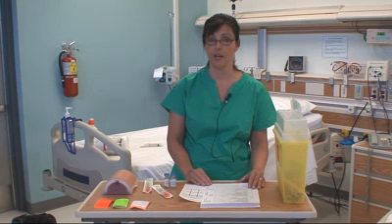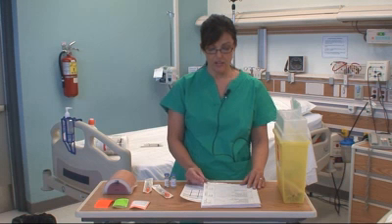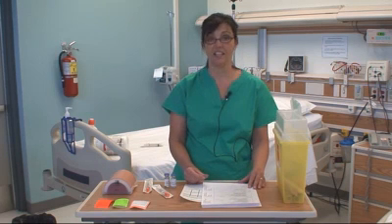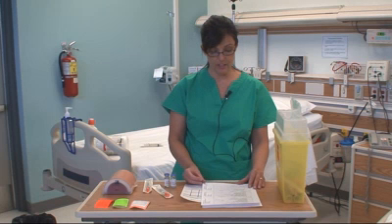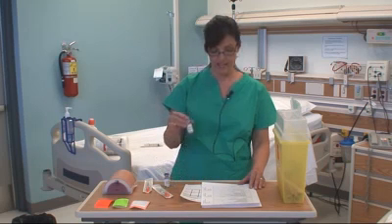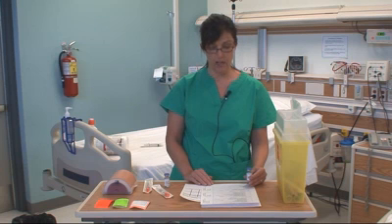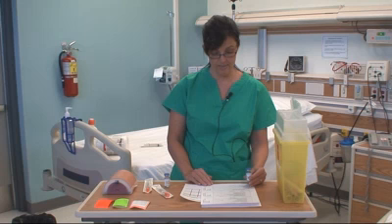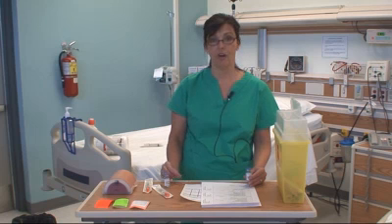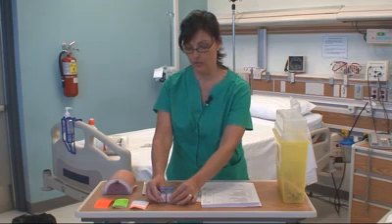We would never administer insulin without having that blood glucose level. So we know that Mr. Montpellier's blood glucose this morning is 11.2, and so according to our doctor's orders, we're going to give 40 units of Humulin N at 7:30. The sliding scale says that if his blood sugar is between 10.1 and 12 millimoles per liter, we are going to give 4 units of Humulin R on top of that. So that's how we're going to draw them up together.